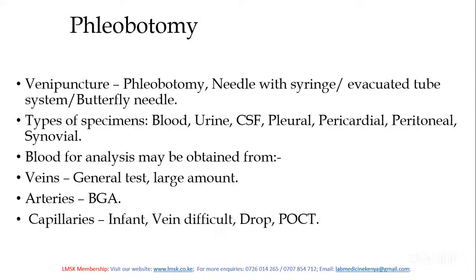For blood specimen, phlebotomy is very crucial for us to get that specimen. This phlebotomy is venipuncture. And what do you need for phlebotomy or venipuncture?